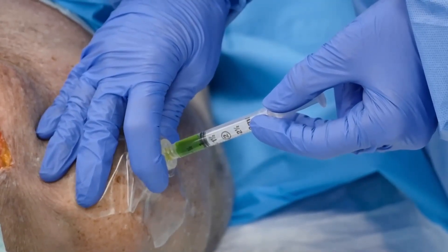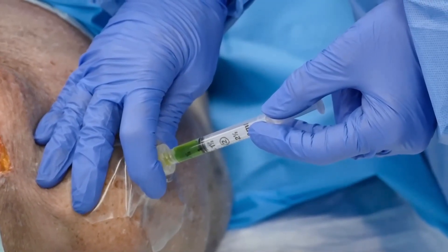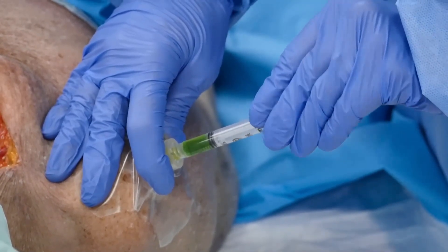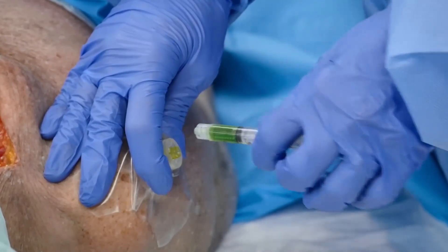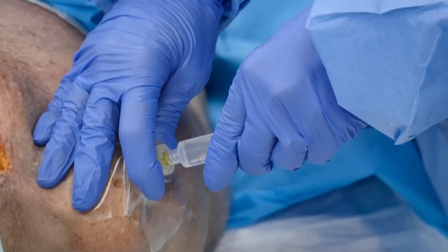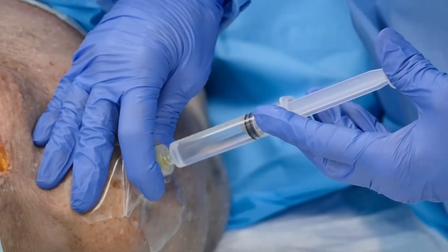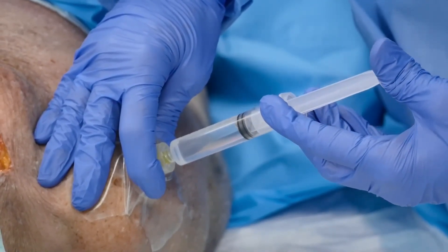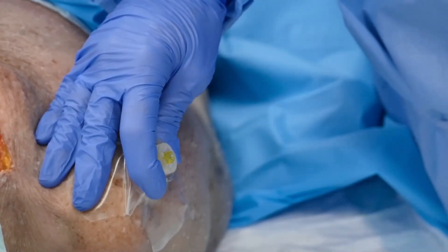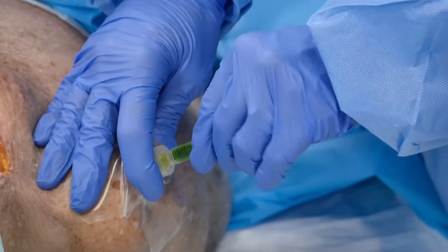You can see that I have attached the syringe directly to the hub of the catheter with the stabilizer in place. Now that it's dwelled for one minute, I'm going to remove the medication syringe and attach my flush syringe directly to the catheter hub, and I'm going to do my five to ten mL saline flush. That's going to open up that pathway for fluids and medications, allowing higher flow rates — especially in the proximal humerus.